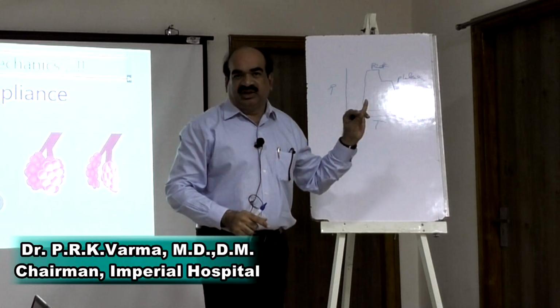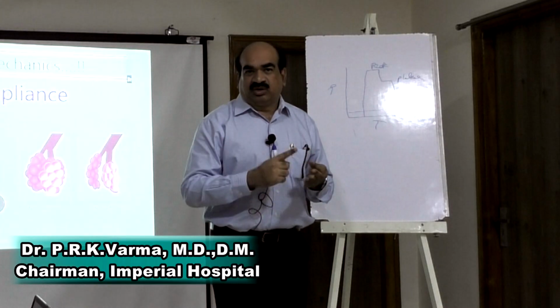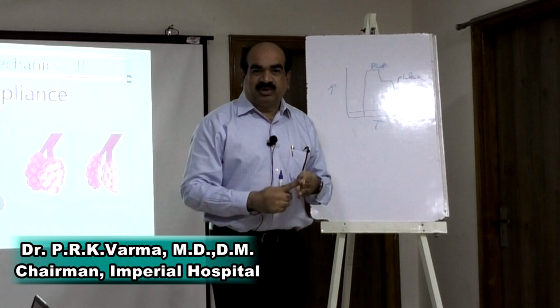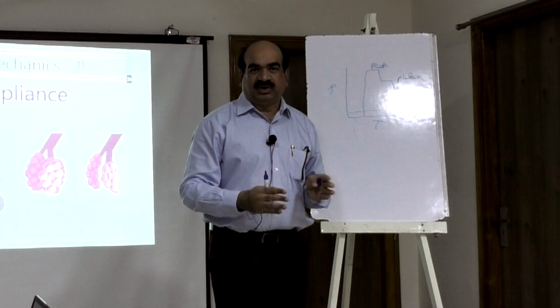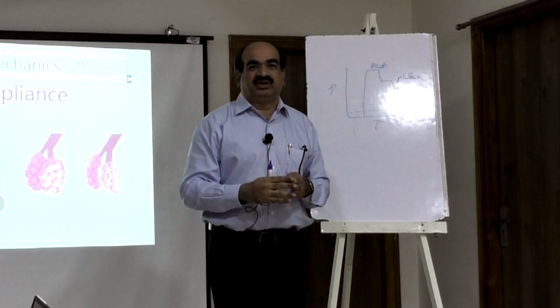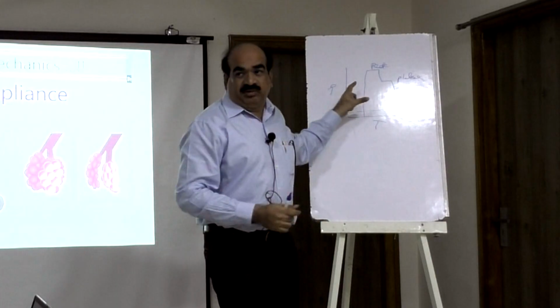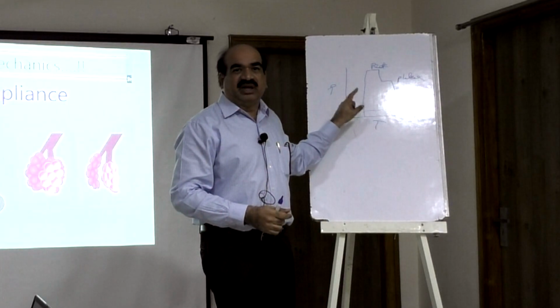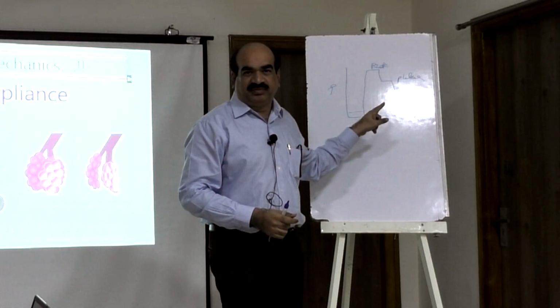In the compliance again, we should know static compliance, dynamic compliance, total compliance, specific compliance, and point of maximum compliance. Point of maximum compliance is found in the pressure volume loop. But in this pressure time scalar, we can calculate static compliance, dynamic compliance, and total compliance.